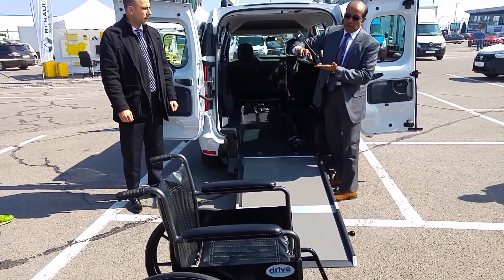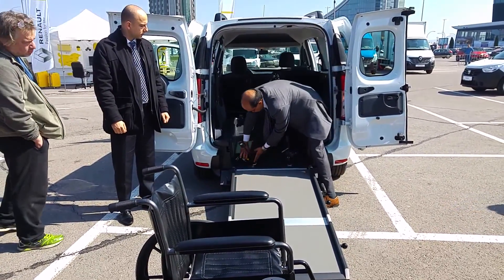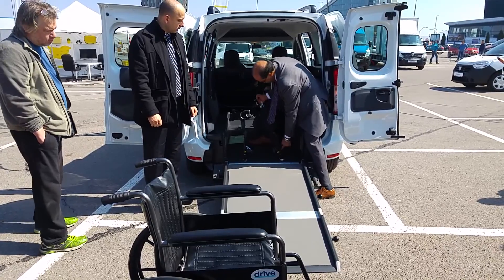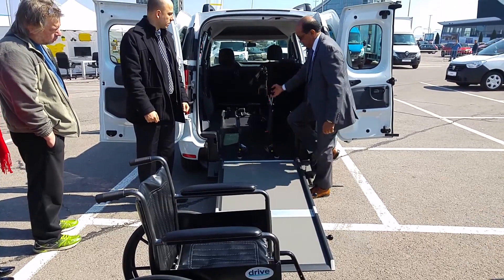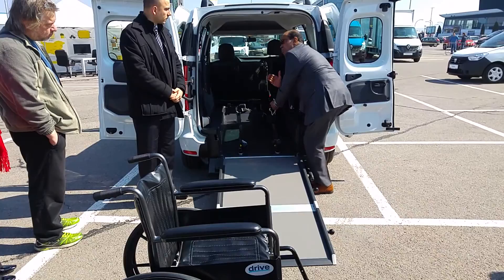The clamps are standard sliding — they are click clamps. So they slide and click. This is from the back of the vehicle, of the wheelchair. So you click at the back of the wheelchair, and then you tighten it so that there's no movement on the wheelchair.